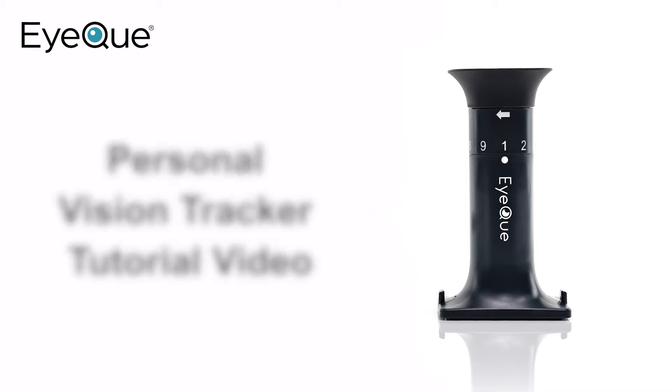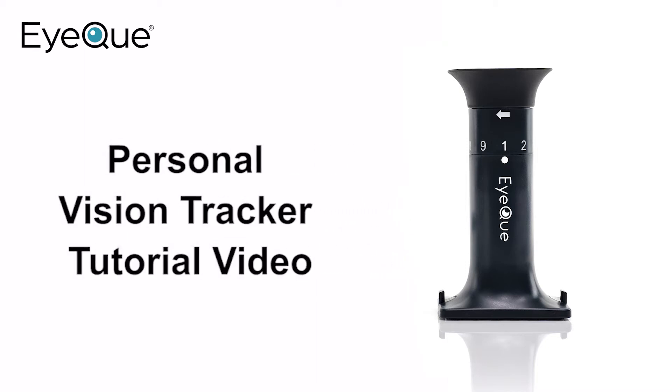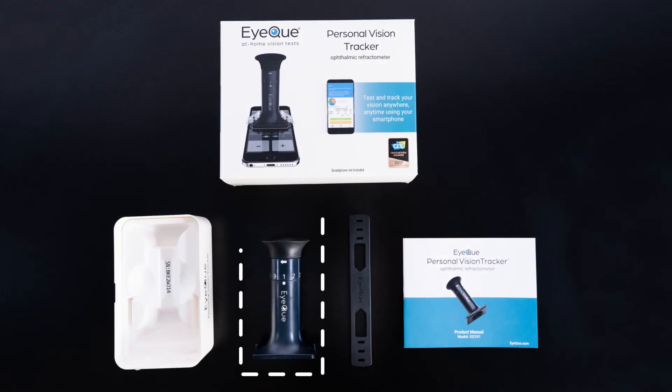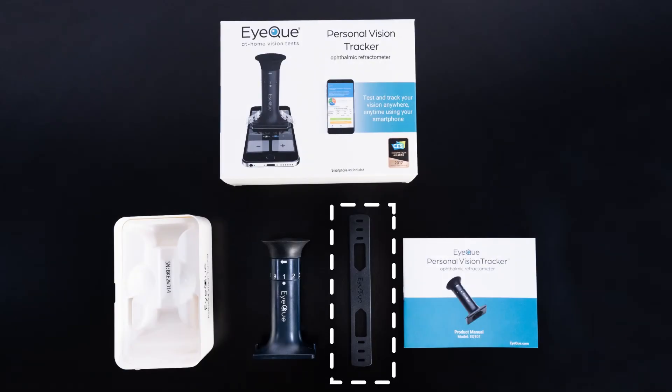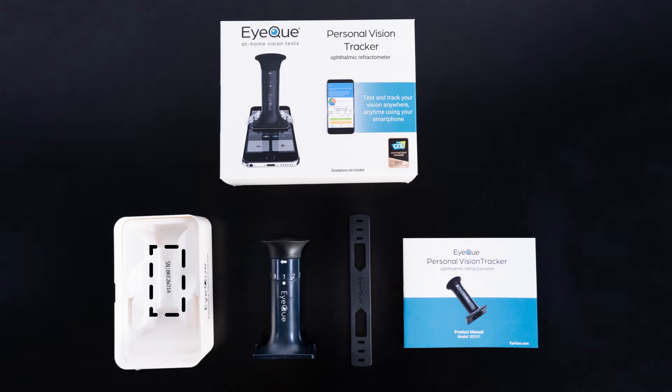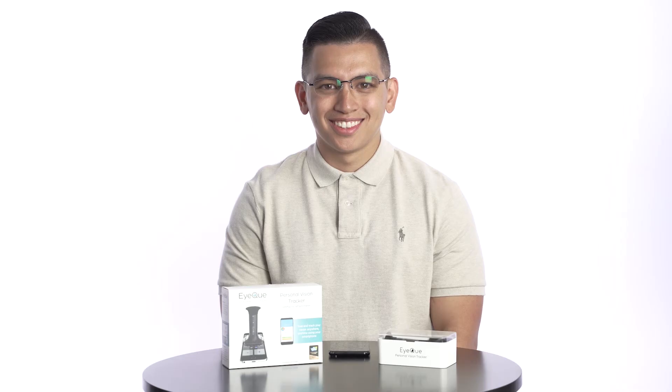Welcome to EyeQue, and congratulations on your new Personal Vision Tracker. In the box, you'll find your Personal Vision Tracker device in its storage case, along with an elastic band, product manual, and your unique serial activation number located in the device's storage box.